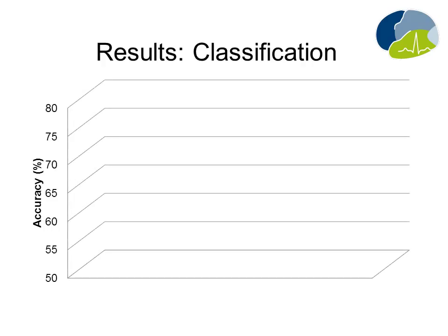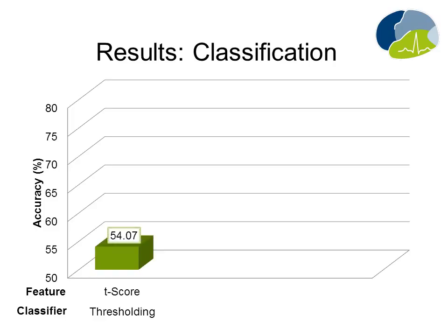As there is no previous study on a similar task, we compare the performance of our method with some other common algorithms. One is thresholding on the T-score map. It's widely used in clinical practice. We calculate T-score maps for all CT images and carefully select a threshold to get the abnormal regions. Then the volumes of the regions are used to identify brains with moderate or severe small vessel disease.